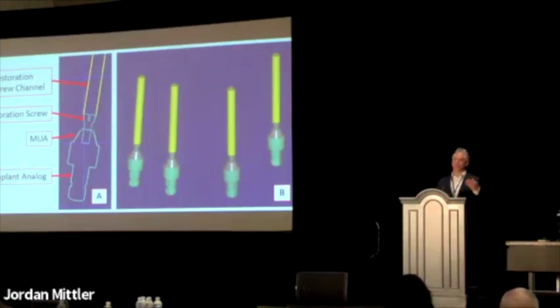So what I like to say, and I say it often, is that photogrammetry in and of itself is actually worthless. All it is, is an implant position. But it becomes very valuable if I want to merge it with prosthetic data. Now it gets very valuable because it has opened the door for digital workflows.